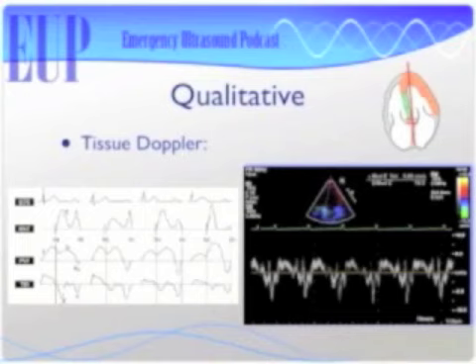Fine. Good man. All right, so let's put it all together here. So now we're looking at tissue Doppler, and in this example, Matt, what do you think about the E prime wave versus the A prime wave? Are you done? Do you need to do nothing else here? I think the E prime is smaller.